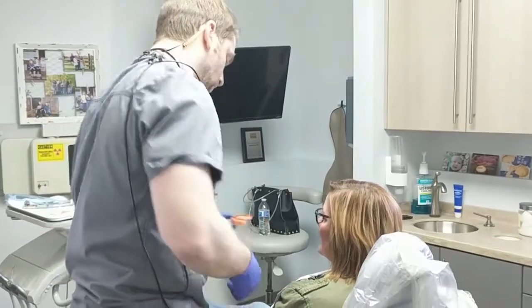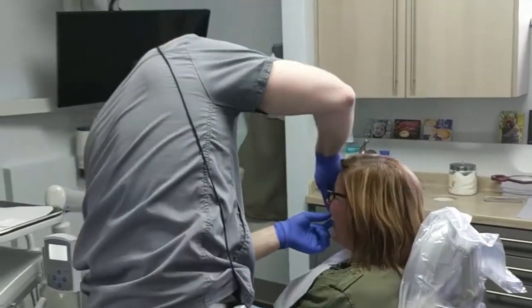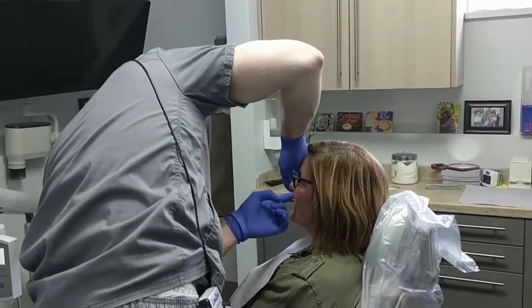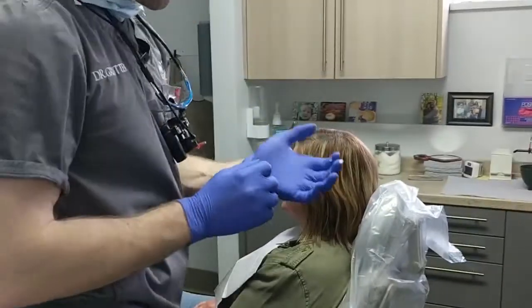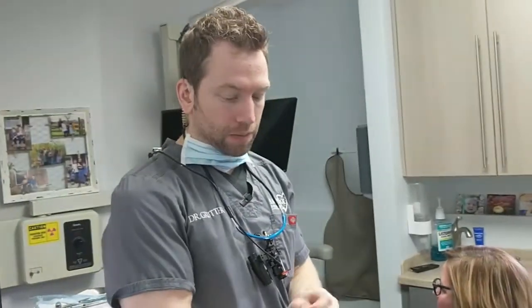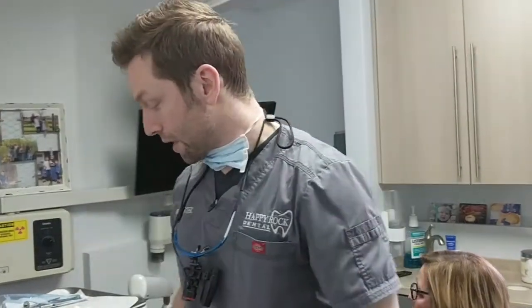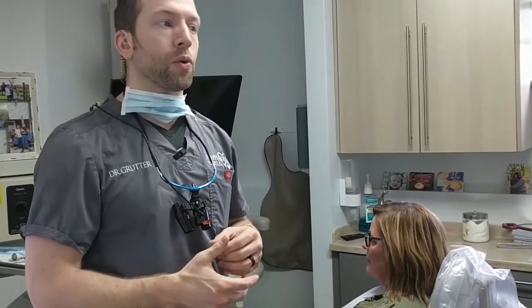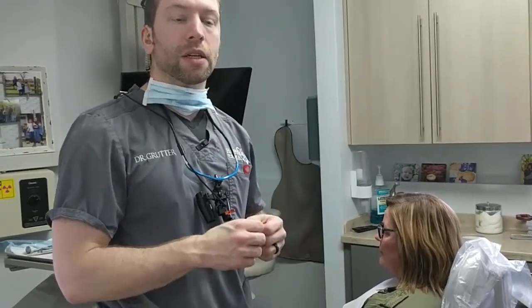We're going to insert this in her mouth and ask her to please not play with the little bumps. Denise is going to take the cone beam scan of Lucy with the denture in her mouth, and then she will take the denture out — carefully, trying not to pop those beads off — and scan the denture by itself. Then we will have both a scan appliance scan and the actual denture-in-mouth scan. That's it.